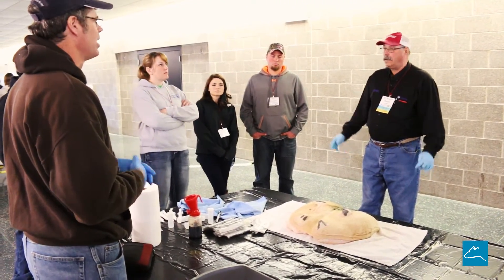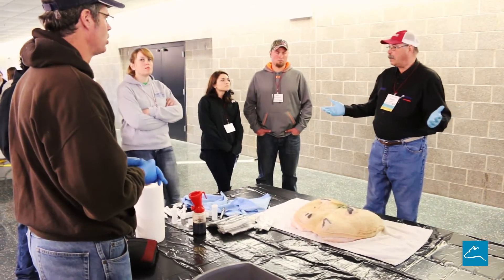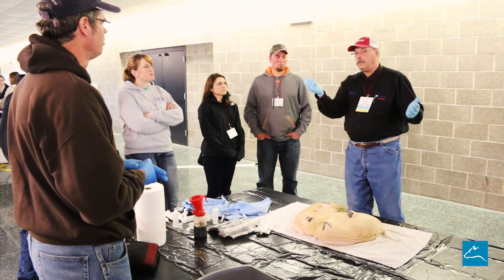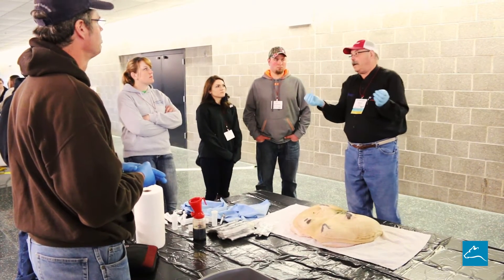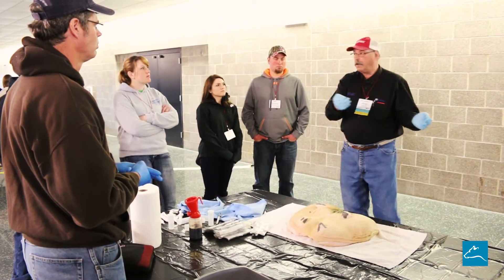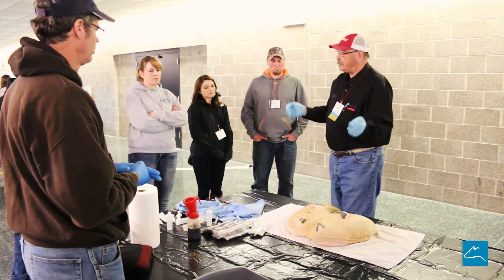In many of your protocols, when you come in and get a hard quarter, you take a culture immediately, put it in your freezer, and then treat it with spectramast or something like that — if you've got a fever, or no milk, depending on what your veterinarian protocol is.